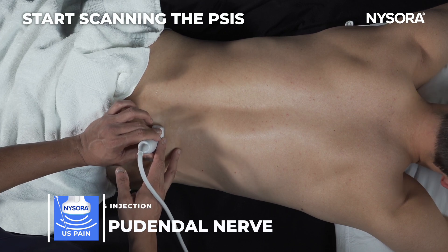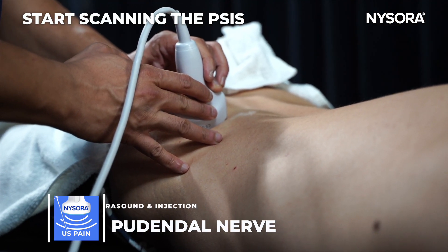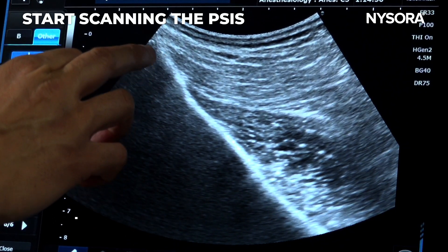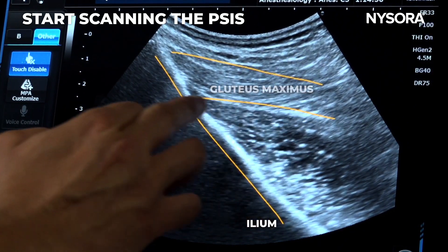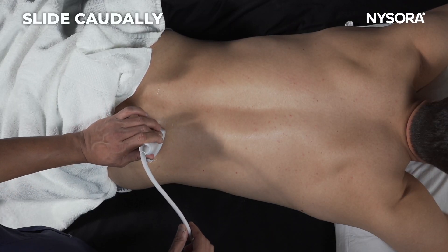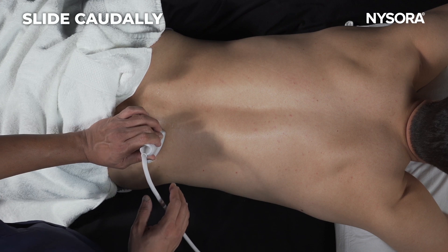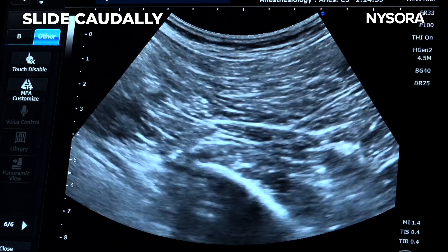Starting at the posterior superior iliac spine and looking for the ileum, which appears as a straight line. Following that, you have two muscles: the gluteus maximus and gluteus medius. Move the ultrasound probe caudad, looking for the curved ischium, and now we are into the greater sciatic foramen.